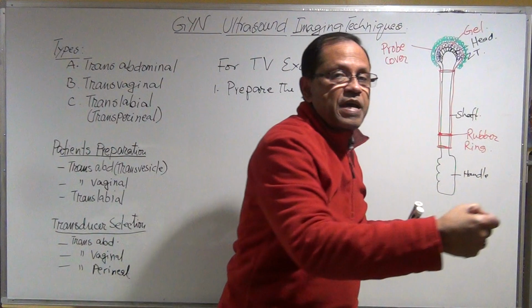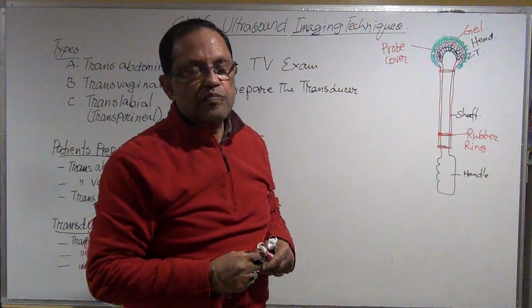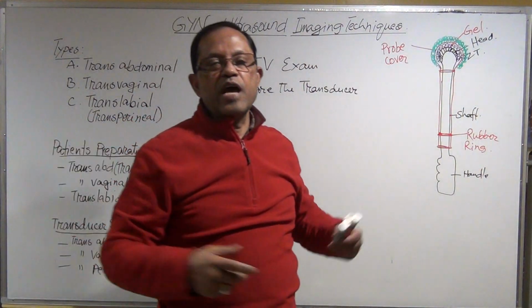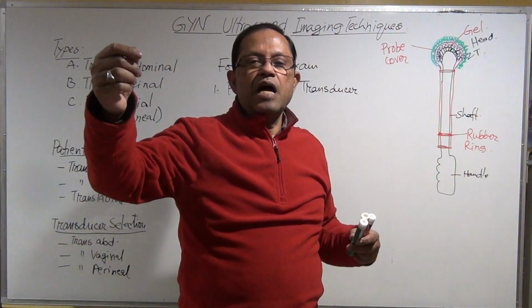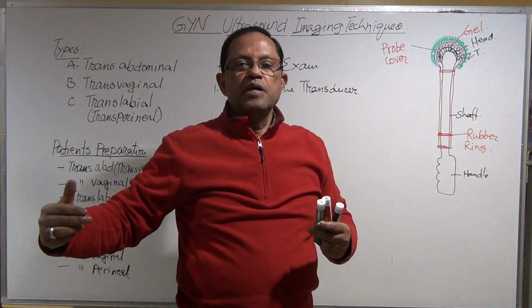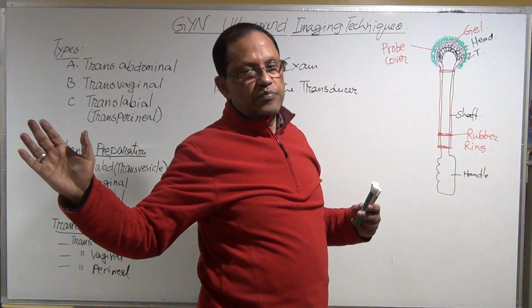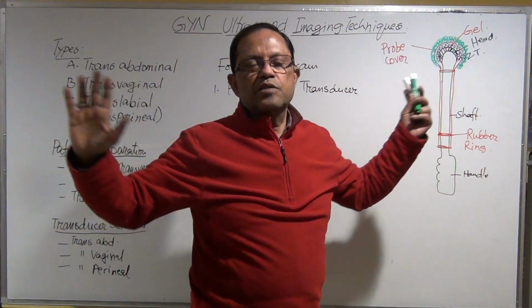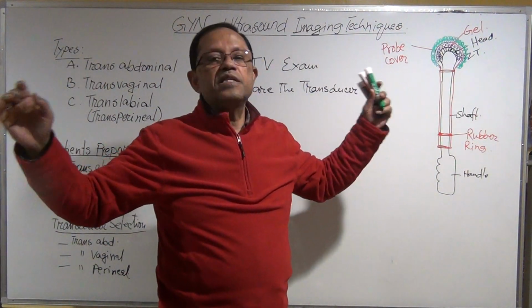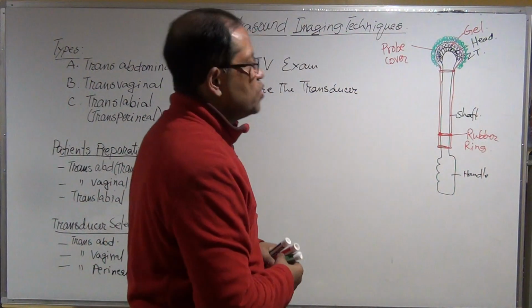Once it is going inside the vagina, then in the monitor you can see it is in the vaginal canal. Then you can say, okay, now you got it. I got it. You can take off your hand. Tell them, okay, I'm holding the handle. It is all covered. Nobody will see your private parts. You just insert into the canal and I will take care of the rest. Okay, and I did so many transvaginal examinations, and it's such an easy technique. Within 7 minutes, maximum 10 minutes, you can finish the whole protocol.